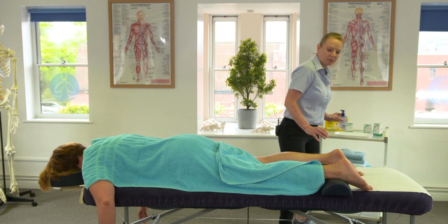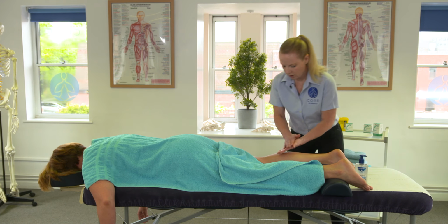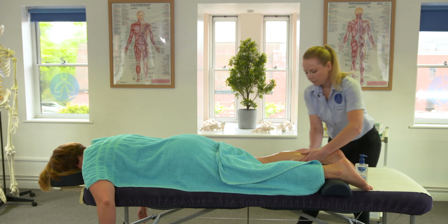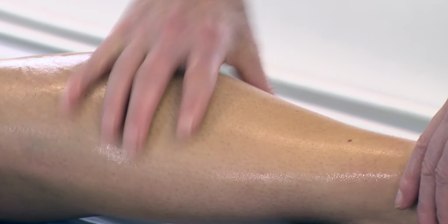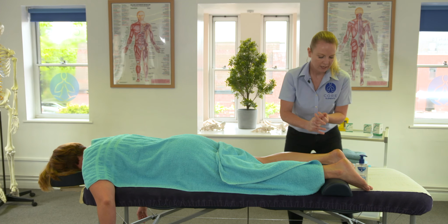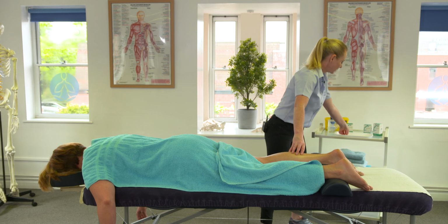For the purposes of today and the size of Katie's muscle tissue, I'm going to use 25 millimetre needles. Okay, so I'm just sterilising the area first with a little bit of antibac. You can use sterile wipes as well if you prefer to in your clinic. So remember, you're going to sterilise your hands and also clean the area that you're going to treat.